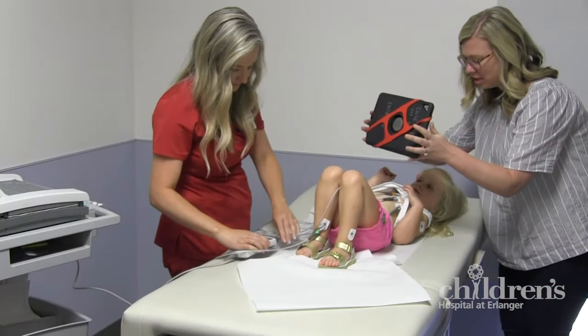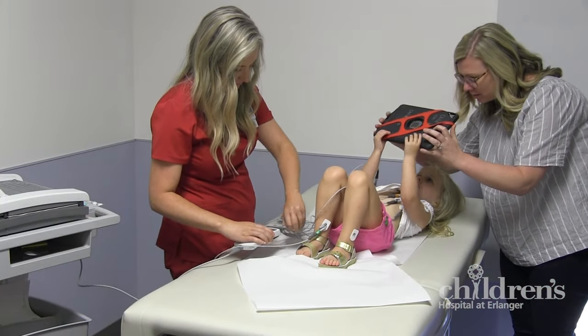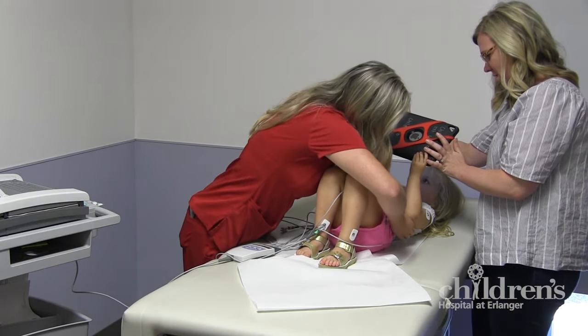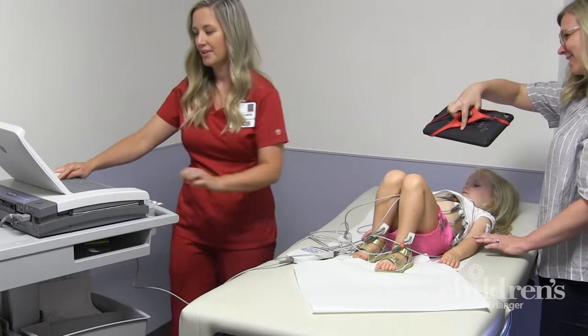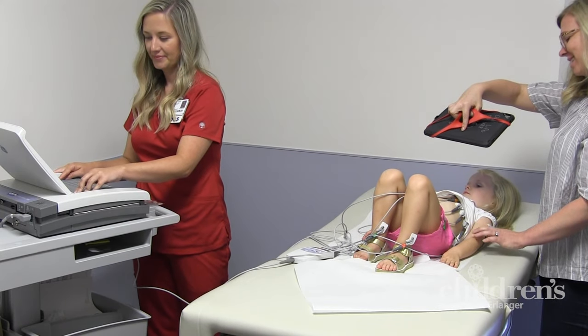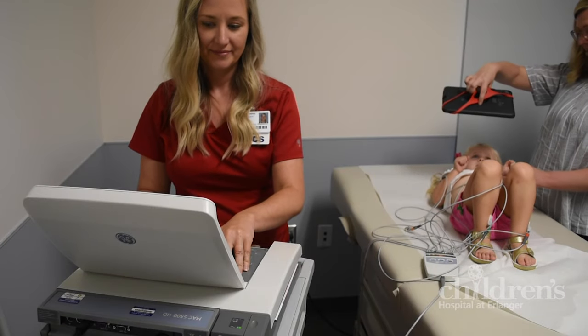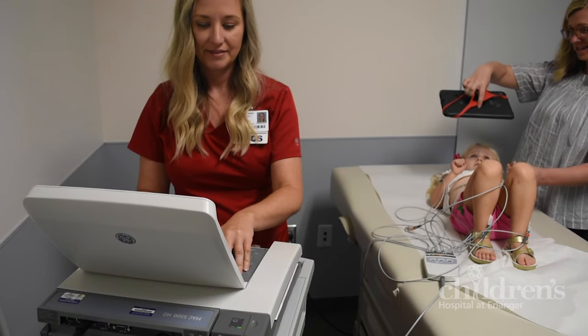We will give you plenty of fun things to do during your exam, and be sure to bring your favorite stuffed animal or toy along to help keep you company. The EKG machine is a special computer that records all the electrical activity and prints out a report for your doctor to look at and evaluate.